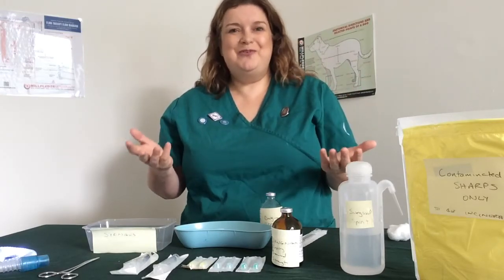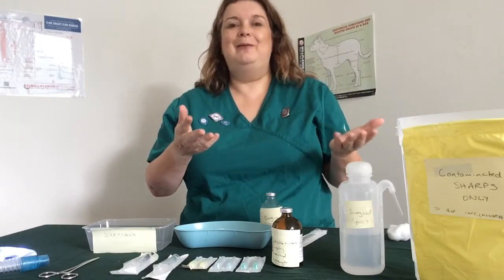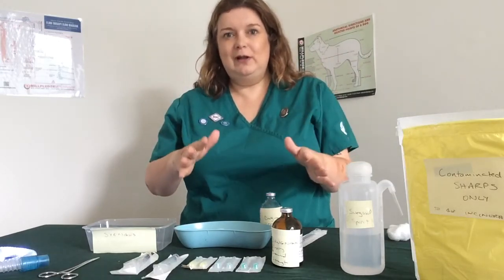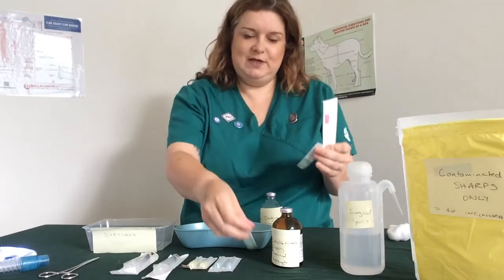If you talk about what to take blood from a cat from, which is obviously in a lab task, which we'll do later, you get the choice of a blue or green, and the camp is split 50-50 as to what's the best. So you're unlikely to fail on needle size, but follow that as a general rule. You want to make this up in a sterile fashion.